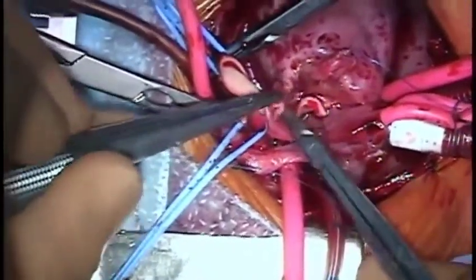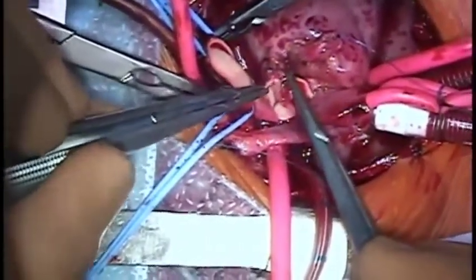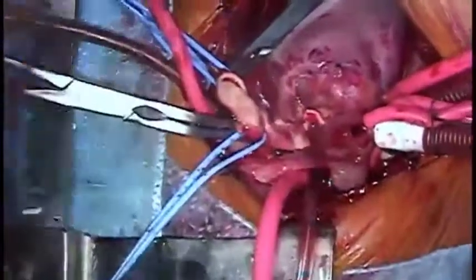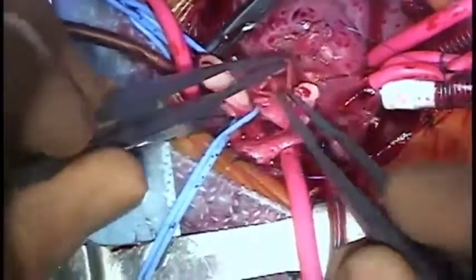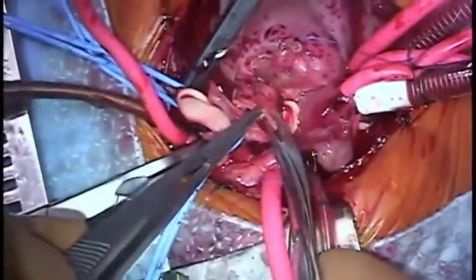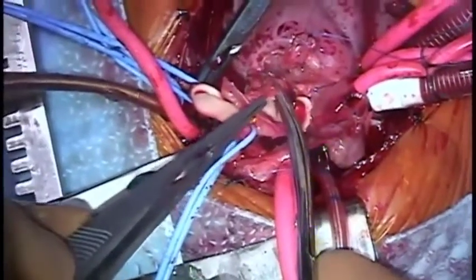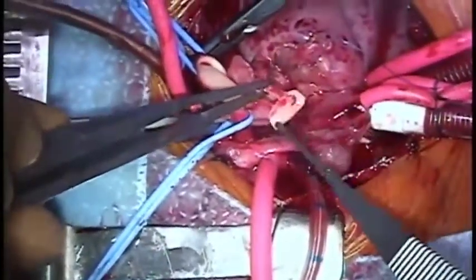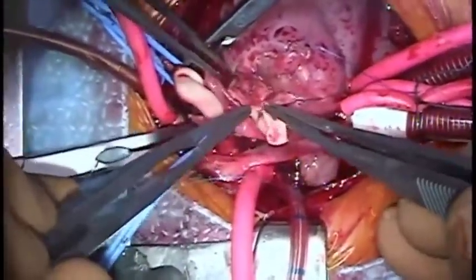The vertical limb of the L can then be reapproximated above the coronary button. Now the position and flap geometry for the right coronary can be assessed. Usually an oblique slit is used to implant the right coronary artery. Keeping the incision fairly high on the aorta reduces the chances of kinking.